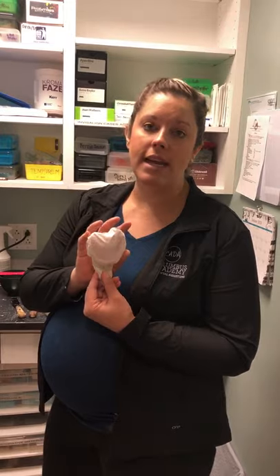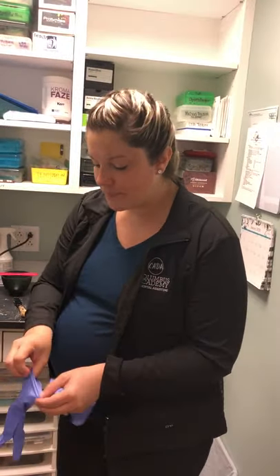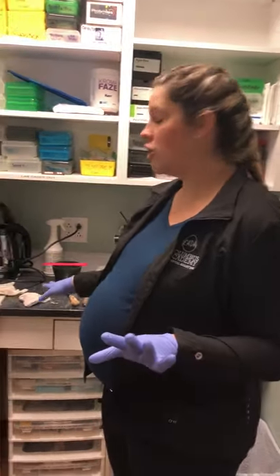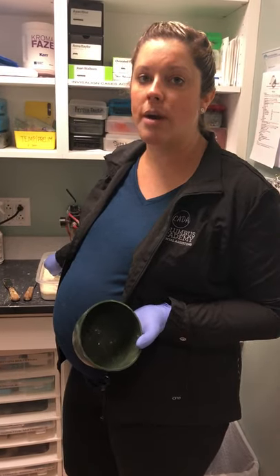We're going to pour ours up now, but I did wrap those as a demonstration. When you go to pour up your impressions, you do want to wear gloves. We took our impressions on a typodont, so there's no cross-contamination, but we want to practice as if we took them on a person. Always have gloves on when touching your impressions. For your state board exam, you only have to do one arch, but I'm going to demonstrate both.